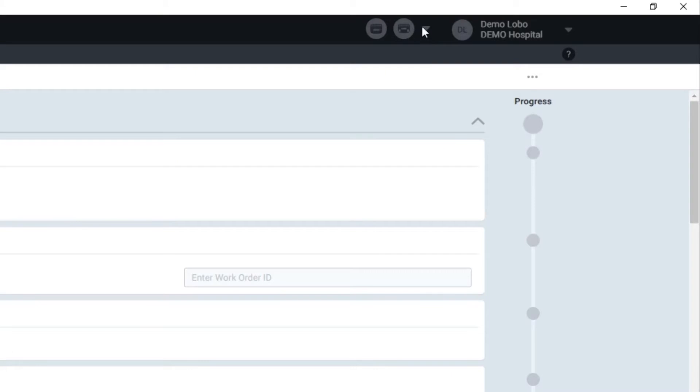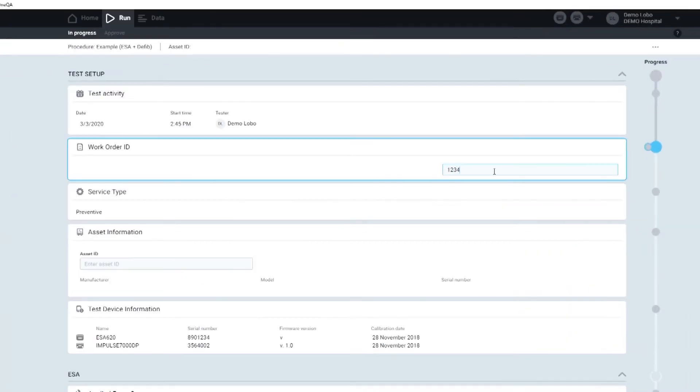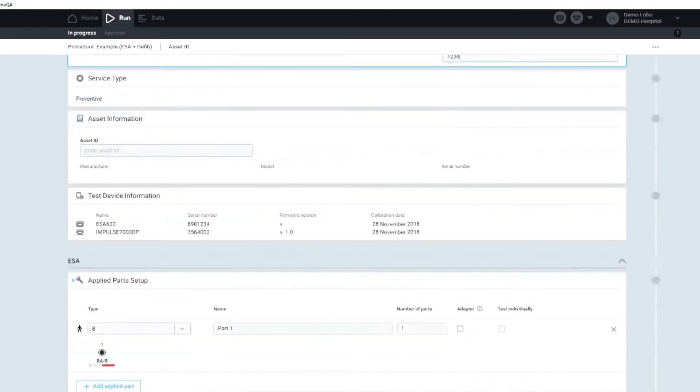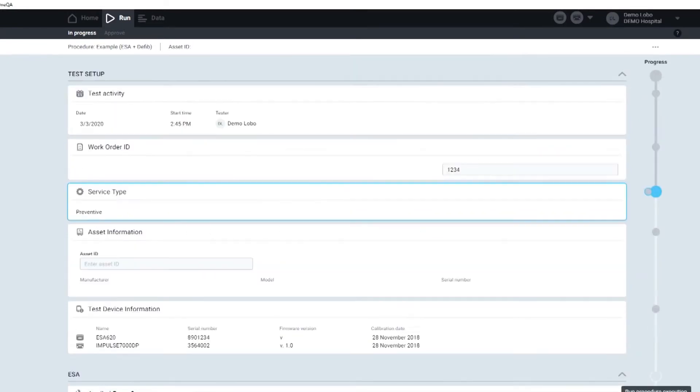So my devices are connected and I will add my work order that I want to send the results to. And all I have to do is press play.